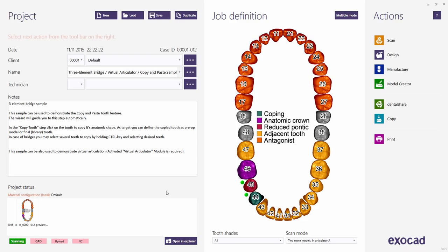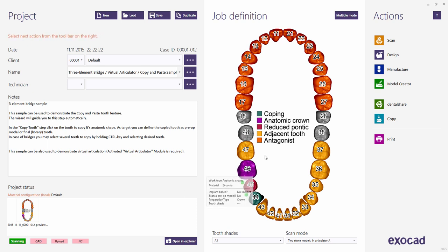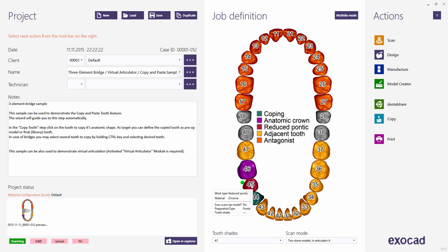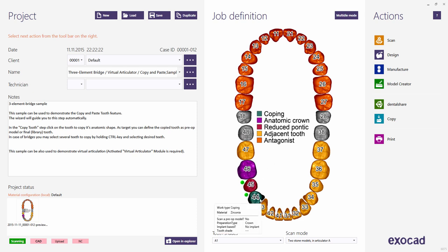This sample's job definition includes three different restoration types. For tooth 46, we defined an anatomical crown. For tooth 45, we defined a reduced pontic. For tooth 44, we defined a coping, which is a reduced crown.